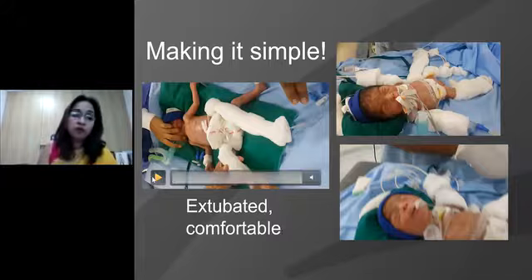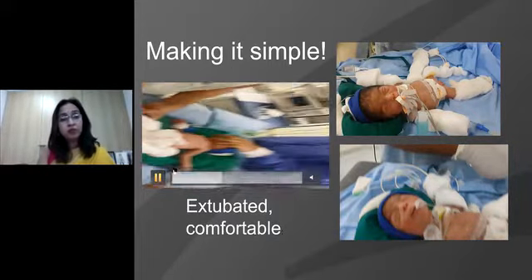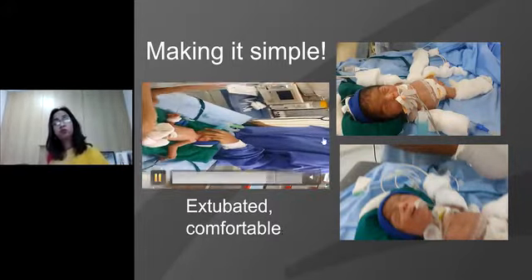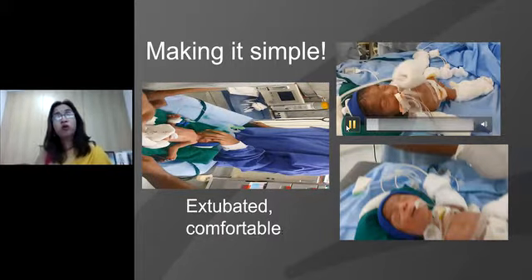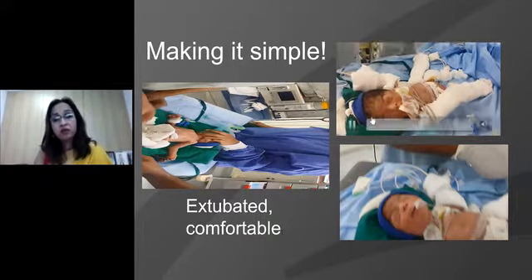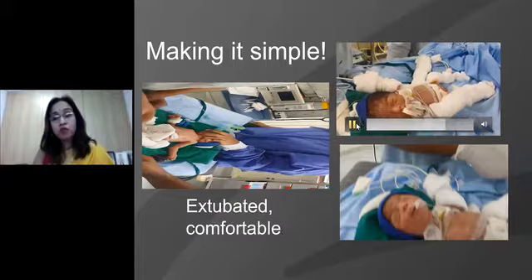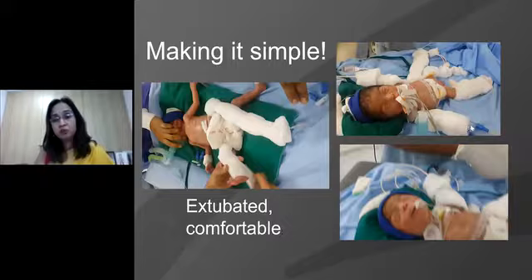So how have we made it really simple is, by this modality, we can avoid opioids, we can avoid even deeper general anesthesia as such. So if we are anesthetizing a small little child of say 1.2 kilograms for an exploratory laparotomy, and then we have induced and we've given a very good caudal at the time of extubation, we can have a very clear, peaceful picture. Let me go back to this particular video.